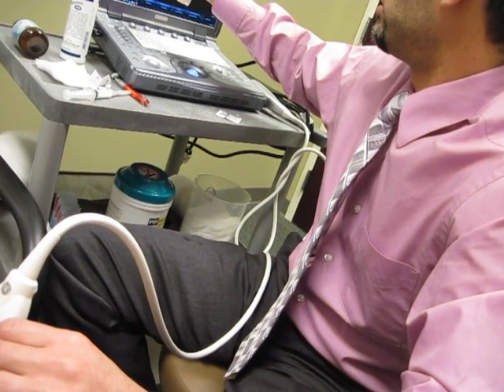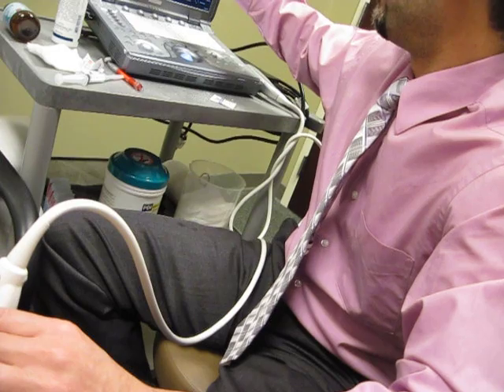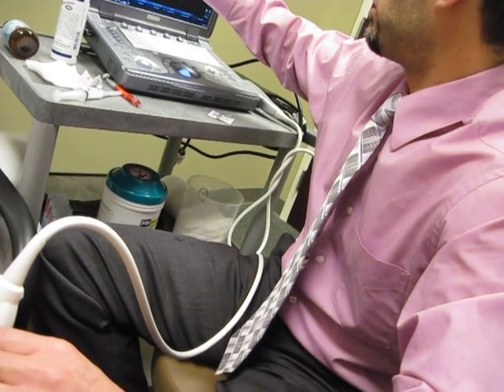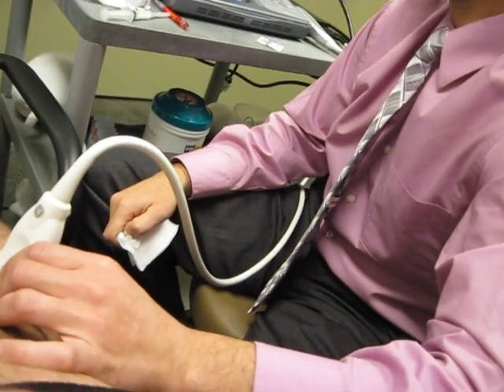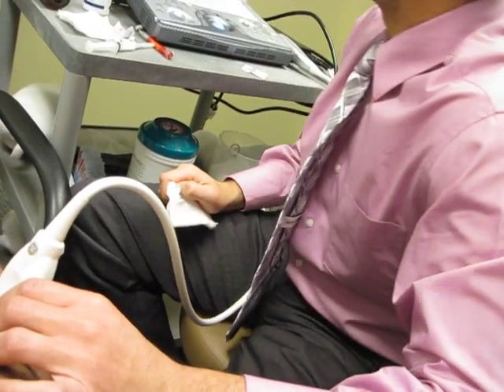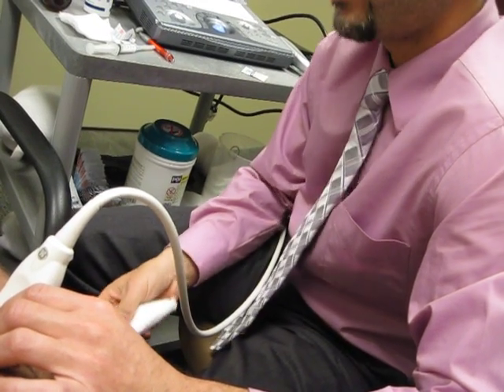The anterior tip is there as well? This is the tibia — the tibia, the Gerdy's tuberosity where the IT band inserts. Okay, so it's inserting all the way. It doesn't look that thick, it doesn't look bad at all. A little bit of... this is the bursa here. A little bit of swelling there.